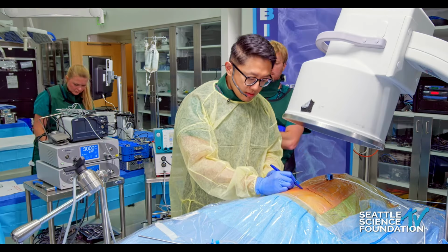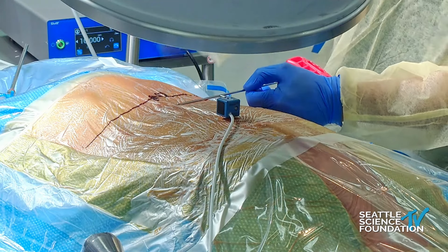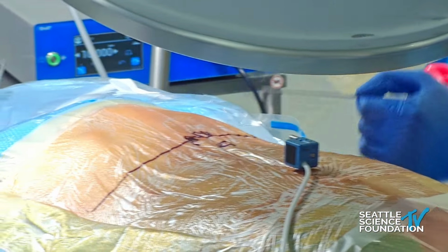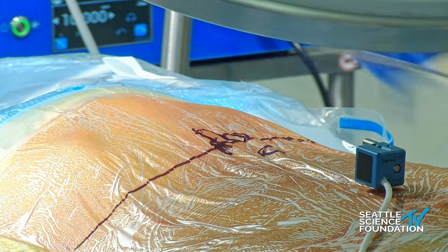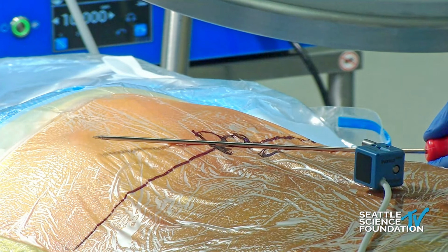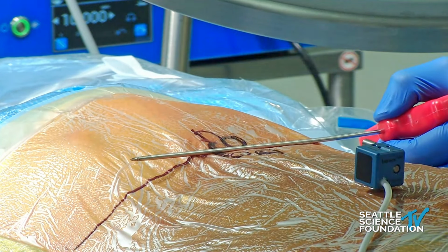Okay, so can you guys also see the surface of the cadaver too? Let's see a shot there. Yeah, we can see the surface. Okay, so I'm gonna just kind of draw out the silhouettes of the pedicles. So for example, if I'm gonna go for, say, a caudally extruded disc herniation, then I know that my angle needs to be something like this, right? And then I'm gonna take away some of that pedicle. Conversely, if I'm going for a cranially migrated disc, I'm gonna take a more flat trajectory.